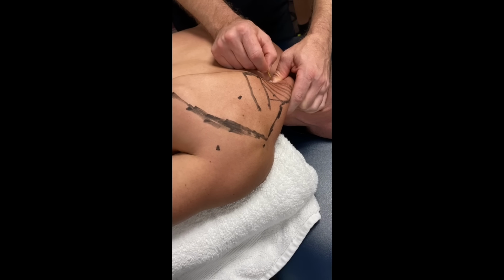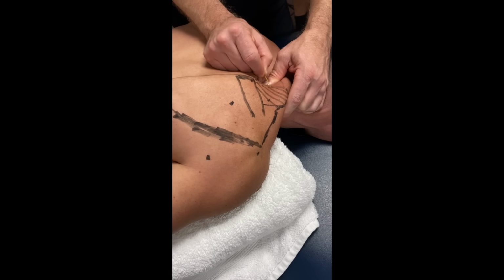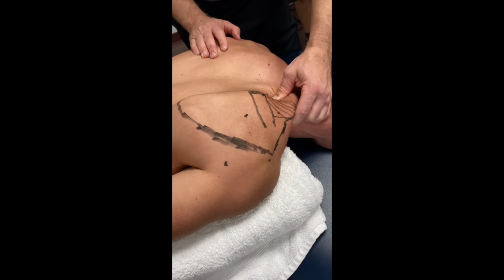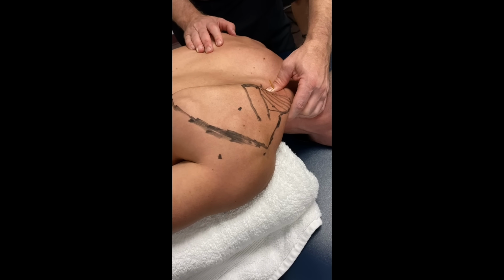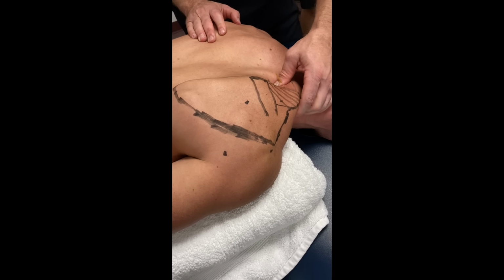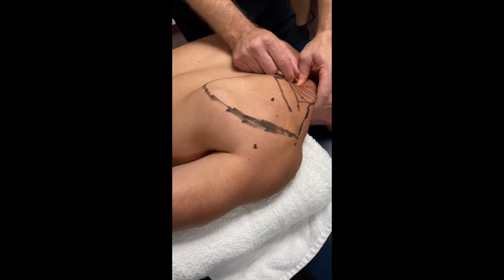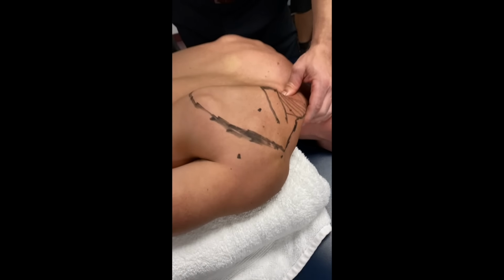Trying to reproduce his symptoms, but at the end of the day, you absolutely cannot leave this needle in. This has got to come out because look, if I let this go, look where that needle's going. Look, look, right towards the apex of the lung. Right? So this is get in, get out, but it has to come out.